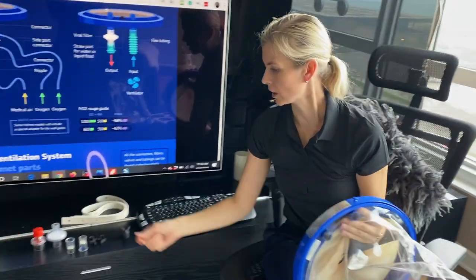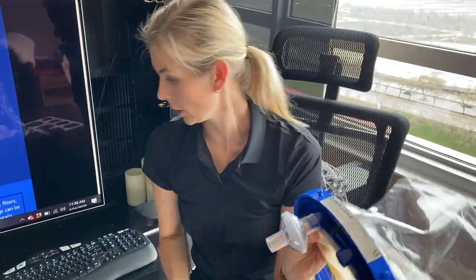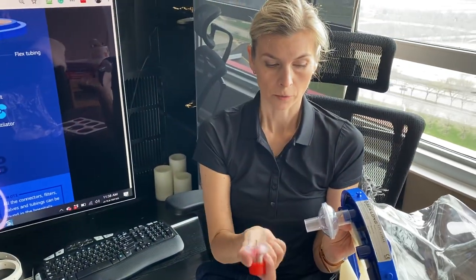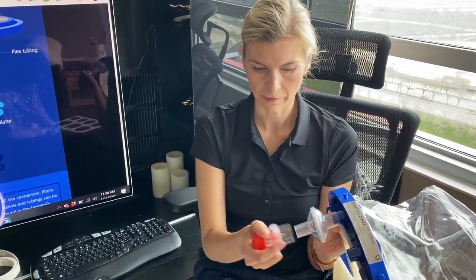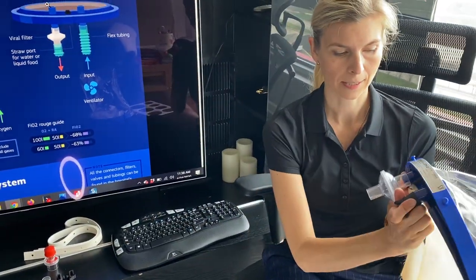Other connectors in the kit include the filter, which is nice — you can connect the filter here — and the PEEP valve. There is also a connector in between so everything fits together.